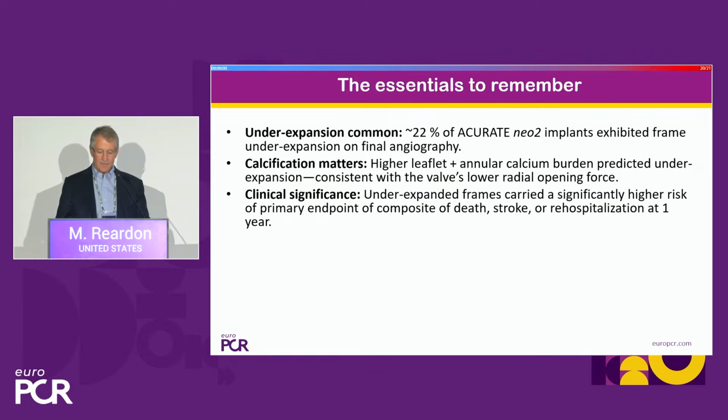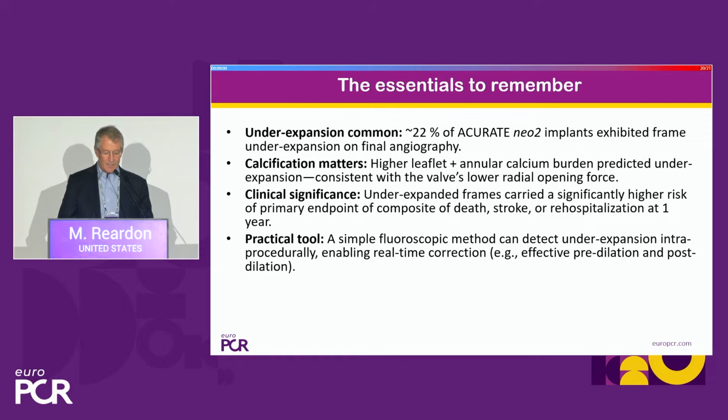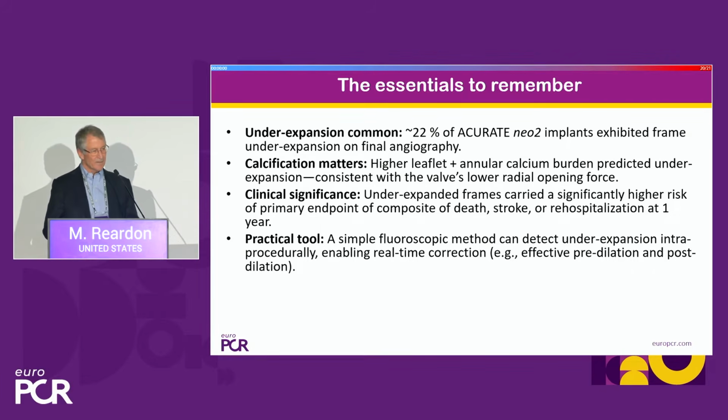The clinical significance of underexpanded frames is a significantly higher risk of the primary endpoint, a composite of all-cause death, stroke, or hospitalization at 1 year. And the practical tool is simple fluoroscopy, which can tell you if these valves are underexpanded. It's really easy to see, and it enables real-time identification and correction of this.